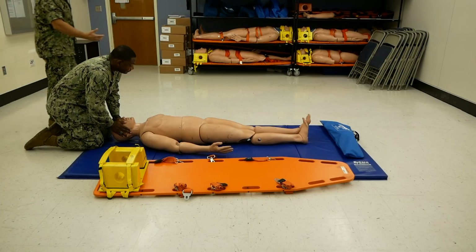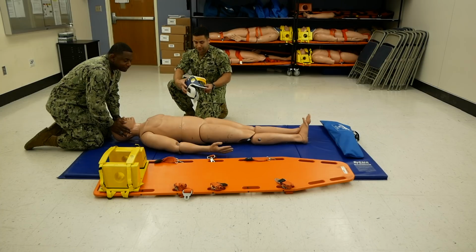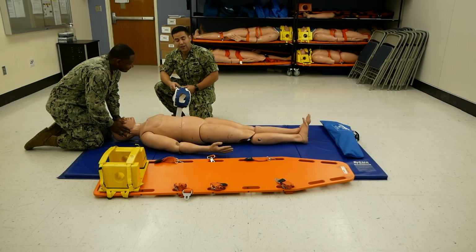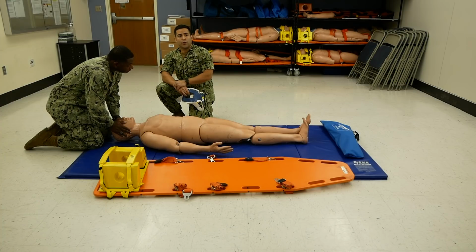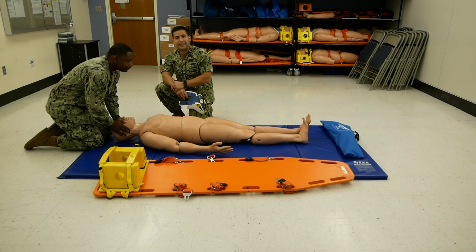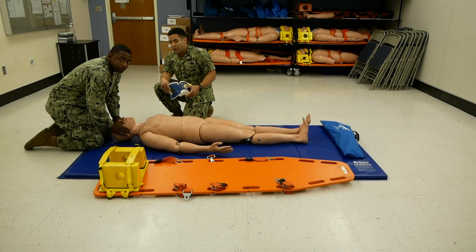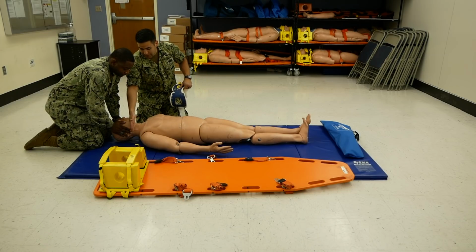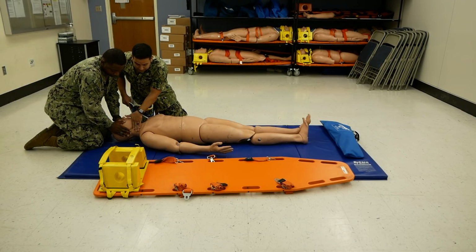My assistant will continue to hold C-spine stabilization until the very end of the lab. For applying a proper C-collar, the directions are actually on the back of the C-collar, and it shows you exactly how to do it. You want to make sure first to remove all jewelry. Remove earrings, necklaces they may have on their face or neck. Remove any protective headgear if indicated to do so. And return the patient's head to a neutral position. The way you measure is from the trap to the bottom of the mandible.